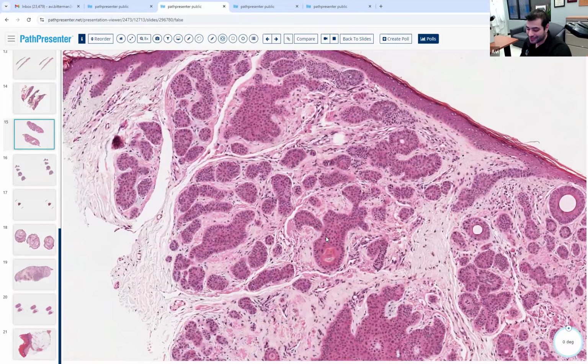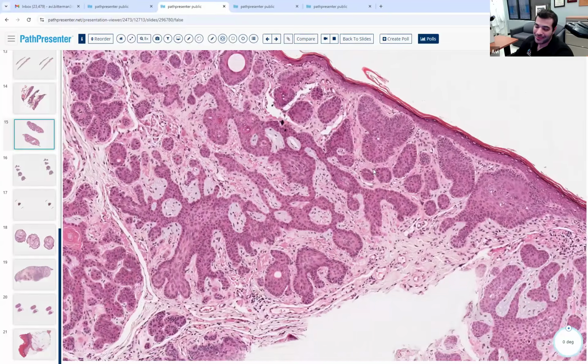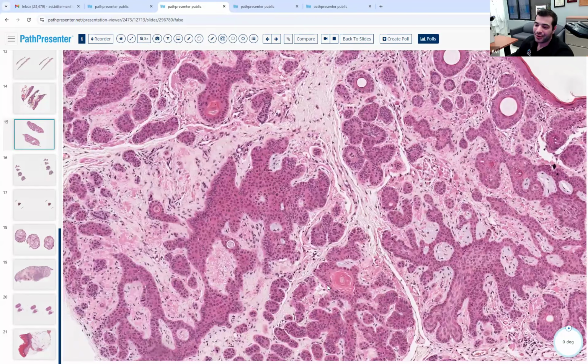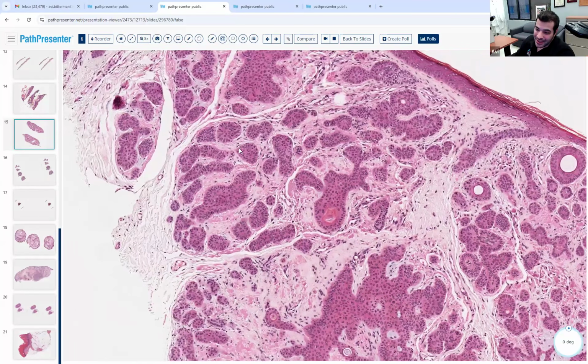So there's a debate. Some people think basaloid follicular hamartomas and infundibulocystic basals are one and the same. You're not responsible for resolving that debate, but you are responsible for identifying clear examples of what one would call one and not the other. In this case, it looks similar.